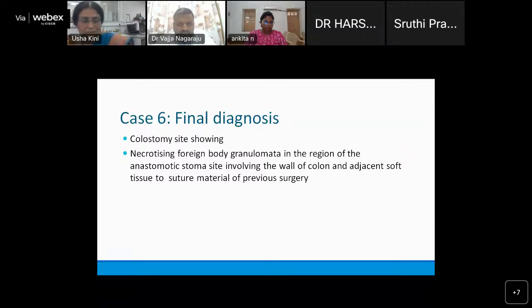Now the hypertrophic nerve bundles that were there, yes. When you have both hypertrophic nerve bundles and ganglion cells, most likely the stoma was in the transition zone. This was a case of Hirschsprung's, treated perfectly normal, except that they were closing the stoma and we were perplexed by these large necrotizing granulomata in the region of the mesentery, which mimic that of medium-sized vessels, but we proved that it is not fibrinoid necrosis. It was a foreign body which had induced so much necrosis.